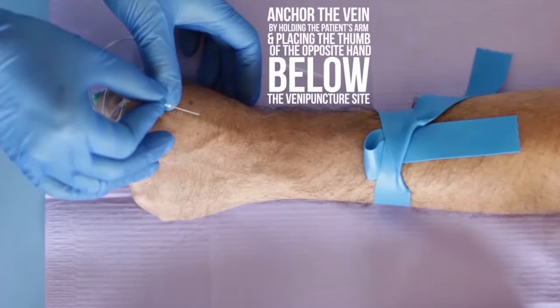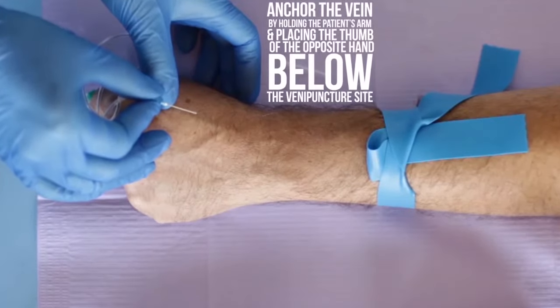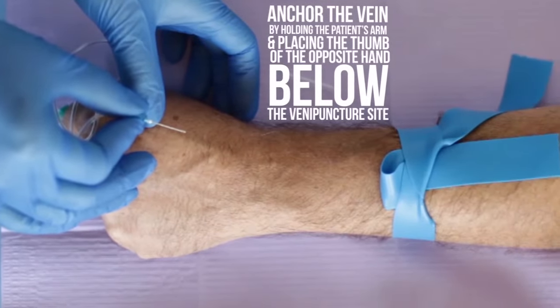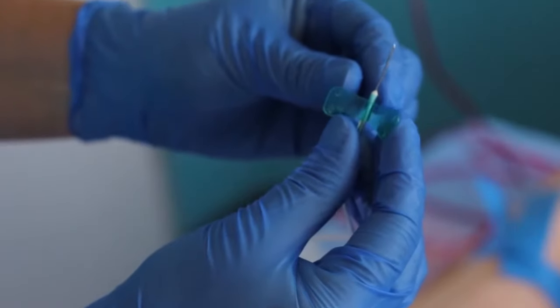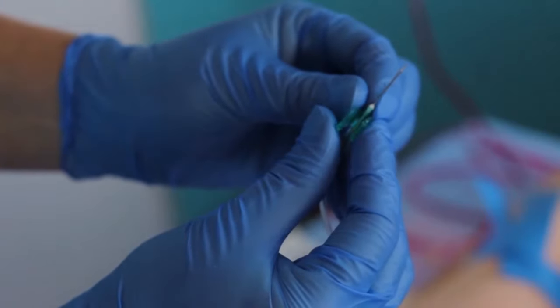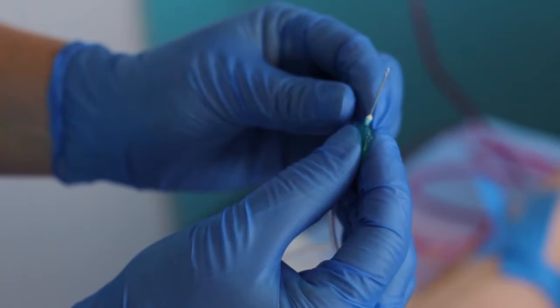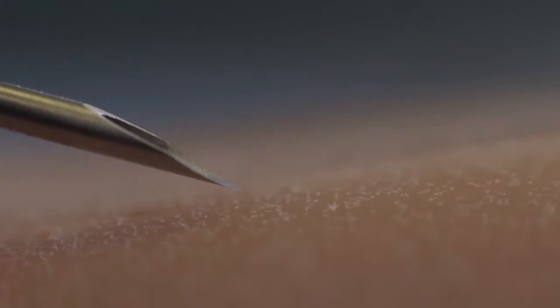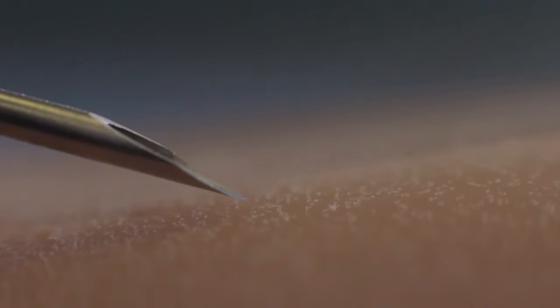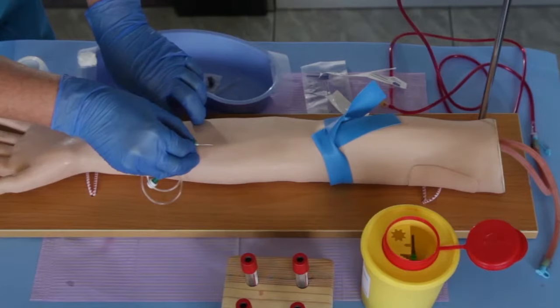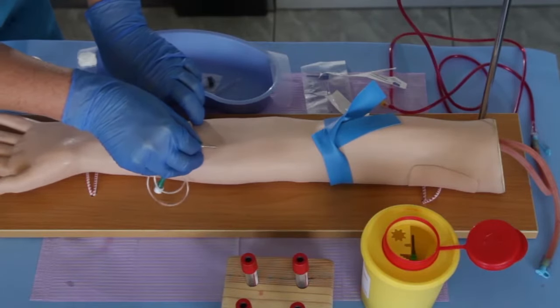Anchor the vein by holding the patient's arm and placing the thumb of the opposite hand below the venipuncture site. Gently bend the two wings of the butterfly together and hold between the thumb and index finger of your dominant hand. Ensure that the bevel of the needle is facing up. Enter the vein swiftly at a 15-degree to 30-degree angle.